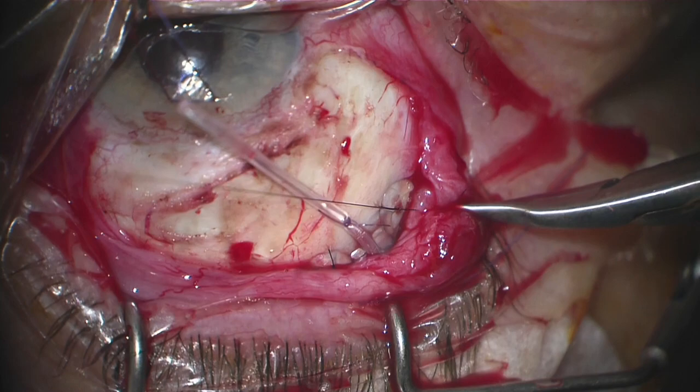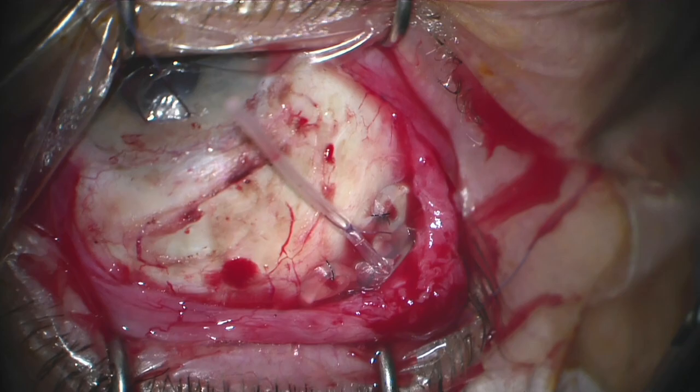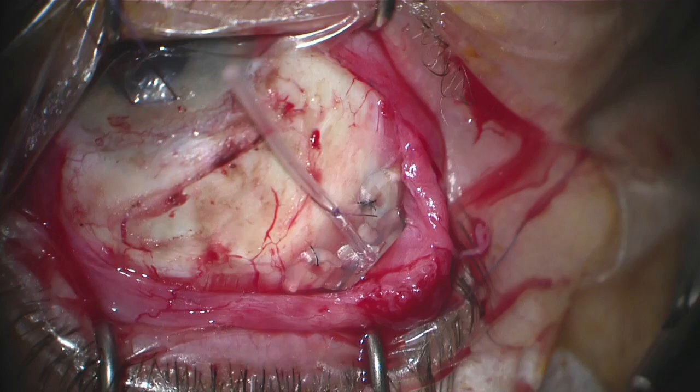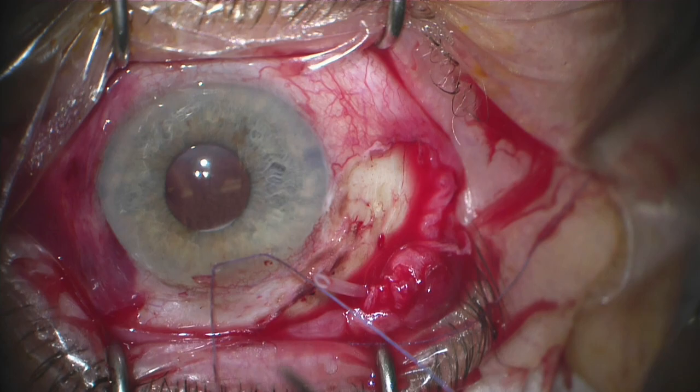After the implant is secured in place and the knots are rotated, I do like to tug on the implant slightly just to make sure that it is securely in place. After this we will move on to implantation of the tube in the anterior chamber. We gently grab the implant, double-check our knots, and then pull the eye back into primary position.